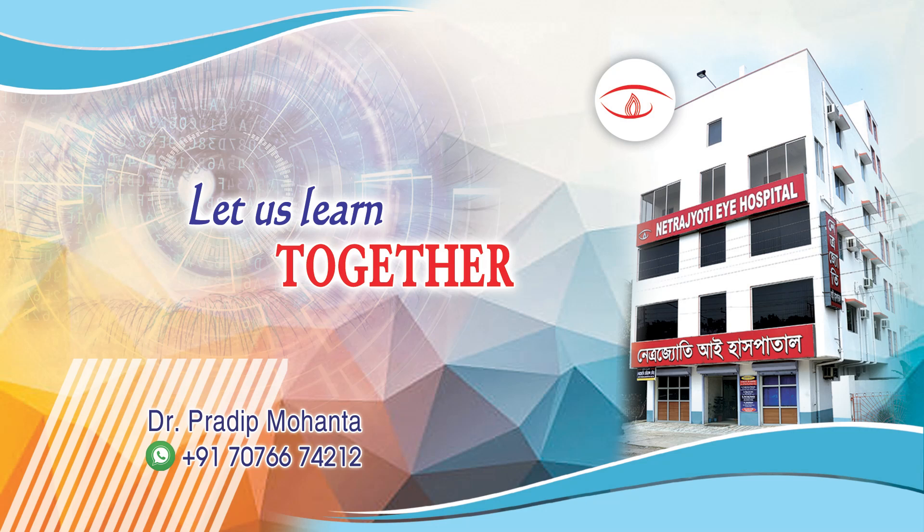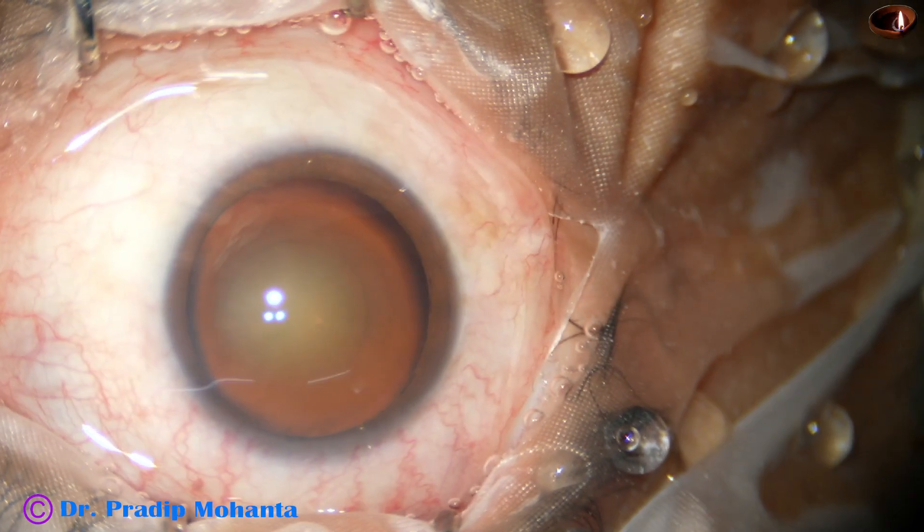Dear colleagues, welcome to my workplace at Ranakh Heart, West Bengal, India. Let us observe this totally unedited surgery.